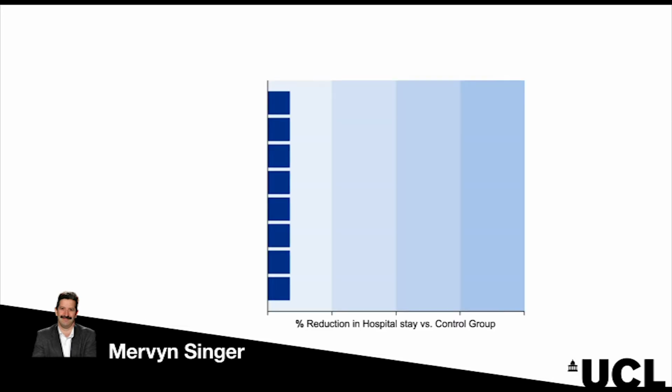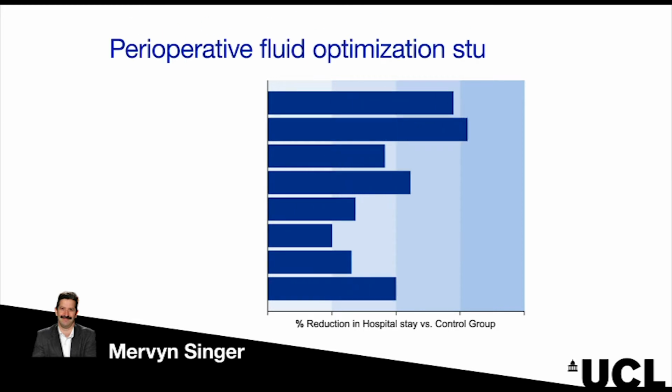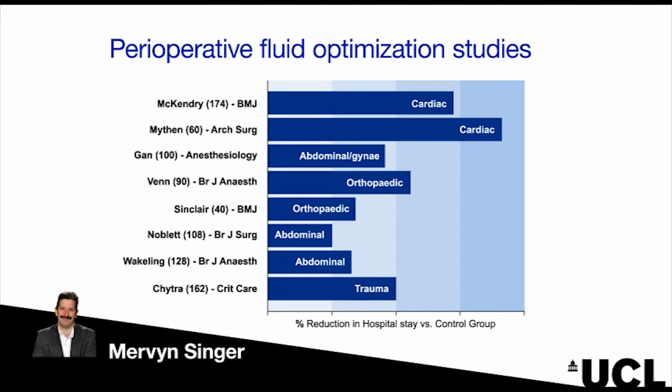And clearly the sound waves you hear on the loudspeaker and the image you see on the monitor can help you correctly orient the probe to midstream flow in the descending thoracic aorta. So you get very different signals if the probe is facing anteriorly towards the heart, if it's facing towards the hemiazygous vein, there's a classic venous signal. If it's too far down, you can pick up celiac axis blood flow. Too high up, you might pick up the pulmonary artery blood flow. And so there's a right depth. There are markings on the probe, so it helps you to insert the probe into a patient of a particular height to the right depth. It might need to be inserted a bit further in a very tall person, or not so far in somebody who's short.